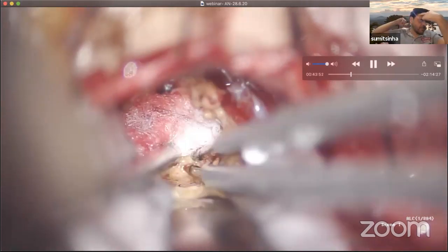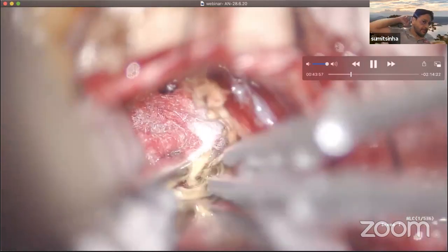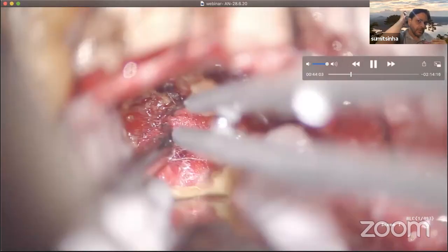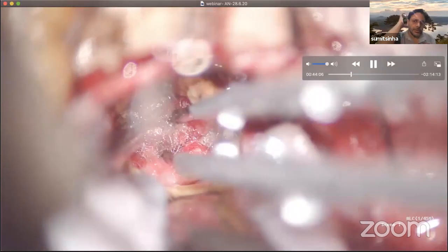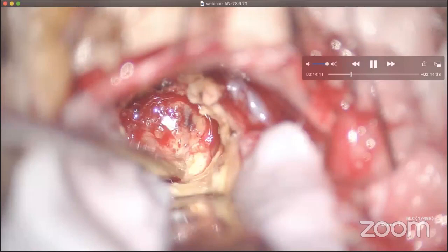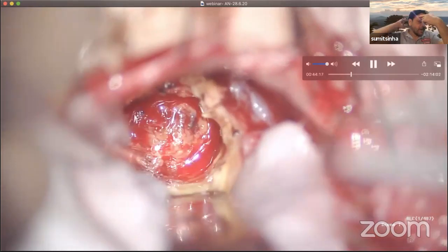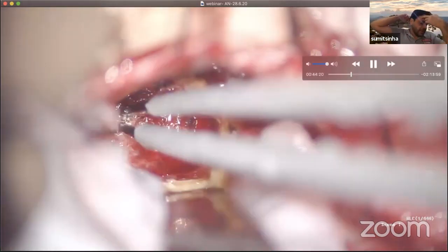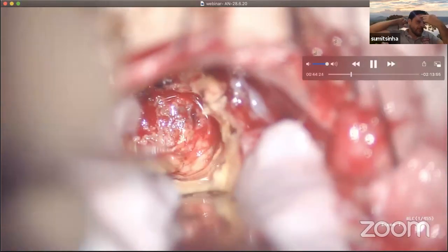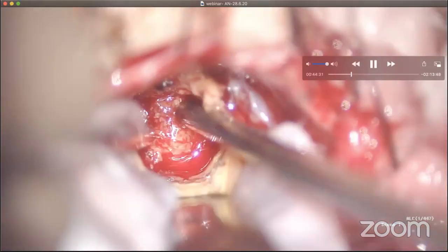Because of these two pins here and one pin there, what you have to see in particular is that the pin applied at the back should not interfere with your hand movement over here. Do you get my point? Okay, another question. I said that in the Mayfield, I apply two pins over here and one pin somewhere near the inion. When you apply one pin near the inion, the point to look for is that this pin at the back does not interfere with your hand movements.